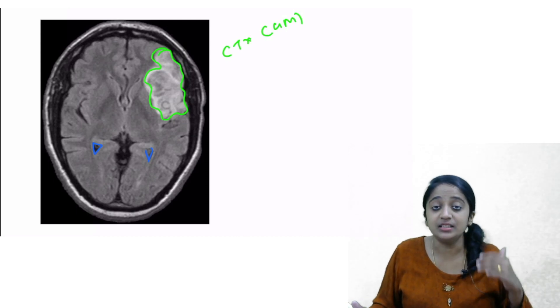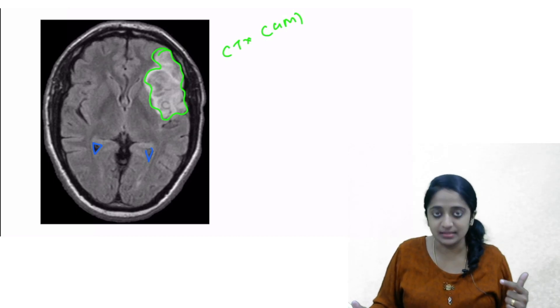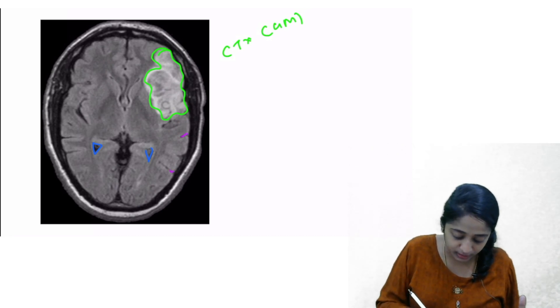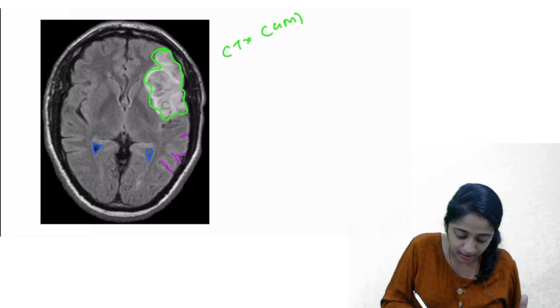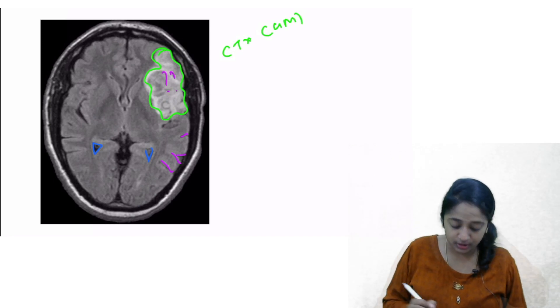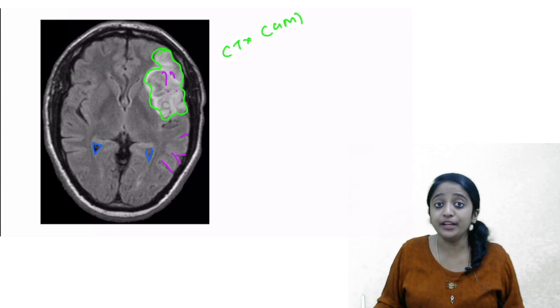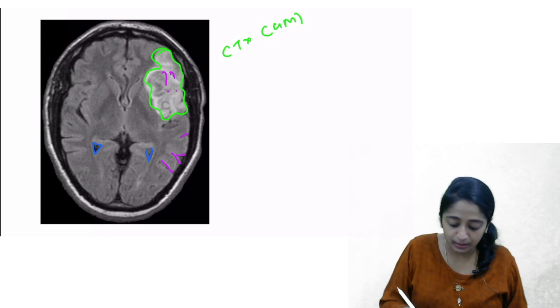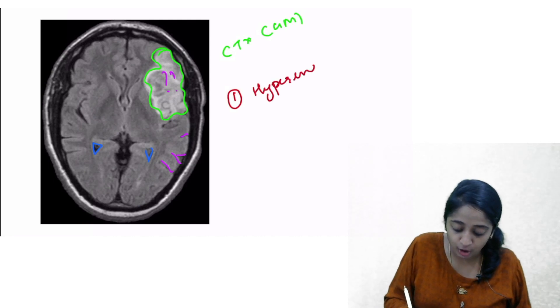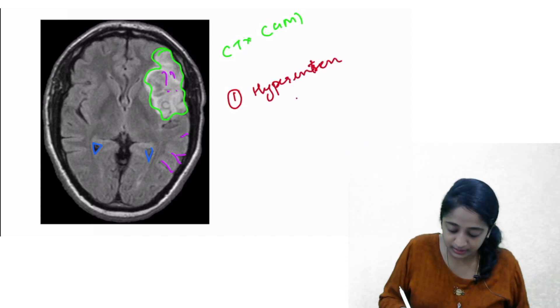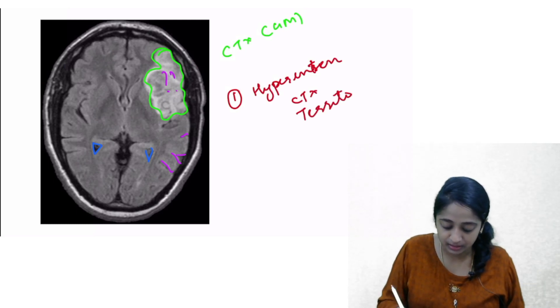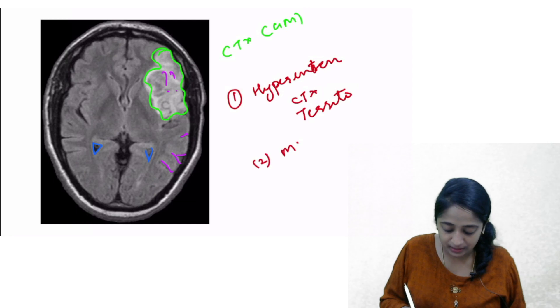Along with hyperintensity, I also see mass effect. How do we identify mass effect? There is effacement of the cortical sulci. These are the cortical sulci, but they are not visible here. So one of the features of acute infarct on FLAIR images is hyperintensity involving the cortex and white matter following a territorial pattern, associated with mass effect.